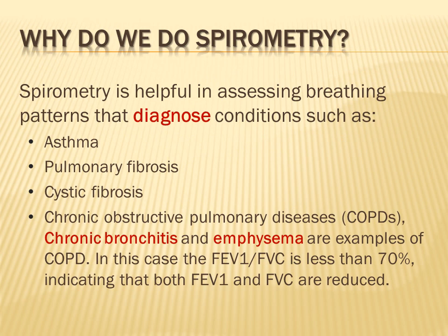Why do we do spirometry? Spirometry is useful in medicine in assessing breathing patterns that diagnose conditions such as asthma, pulmonary fibrosis, cystic fibrosis, and chronic obstructive pulmonary diseases such as chronic bronchitis and emphysema. These are examples of the chronic obstructive pulmonary diseases.